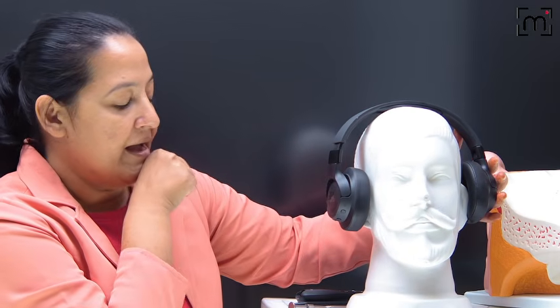Now I will do the second test, the speech discrimination test, in which I want to know the patient's ability to understand speech. Again, I'm putting the headphones, no vibrators, and again I'm testing this ear. I'm giving a set of phonetically balanced words, known as PB. These words have closely similar pronunciation, like cat, bat, mat, but they have different meanings, so they are known as phonetically balanced. The patient can repeat them if the patient can hear and understand. So patient is hearing and repeating.